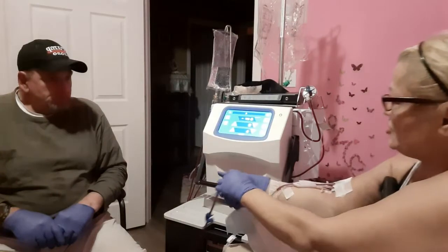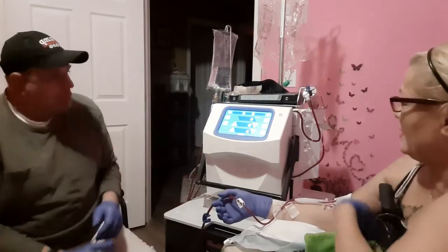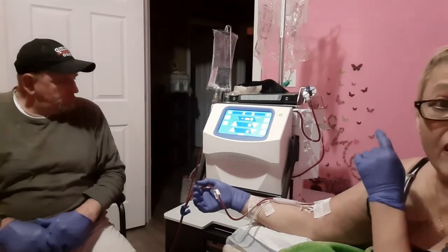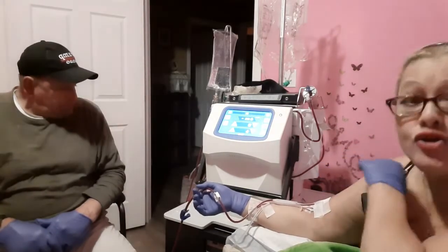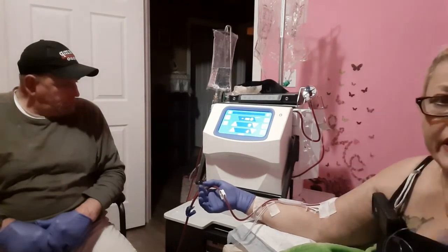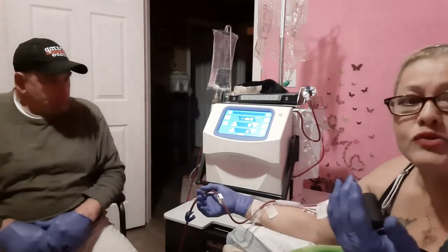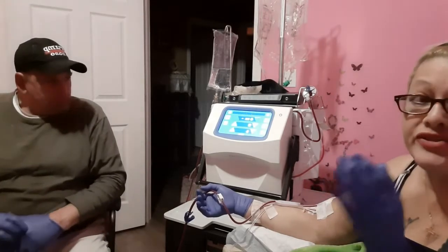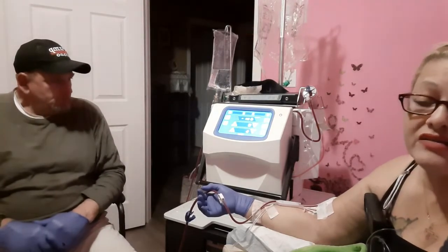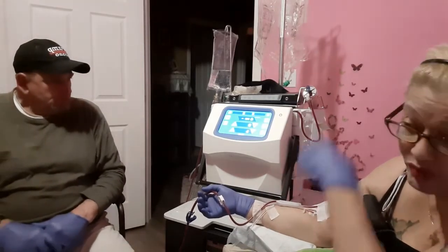So now, we're going to hit the rinse back, which he's going to hit the add fluid button. And now I'm getting my blood back. And with this home hemodialysis machine, you get all your blood back. The dialyzer, this right here, it'll turn clear. Whereas when I was going to the center, those machines, you don't get all your blood back. You know, you get most of it, but not all of it. And the dialyzer, what I call the kidney, usually stays red and your blood is in there.